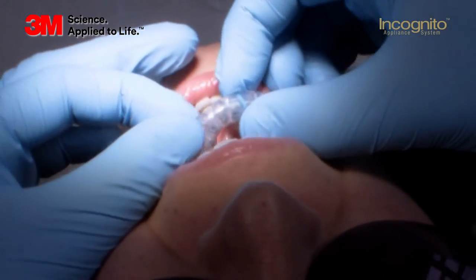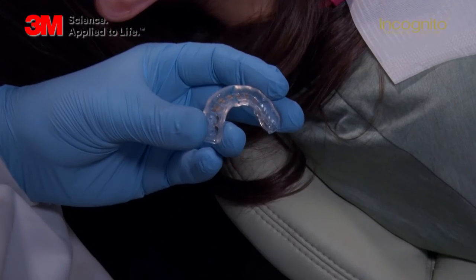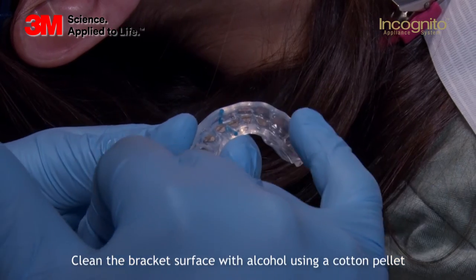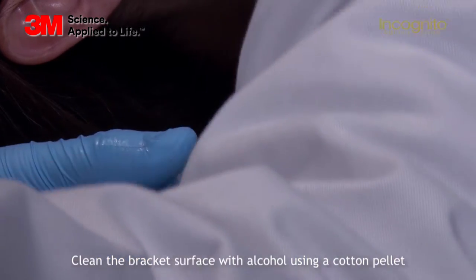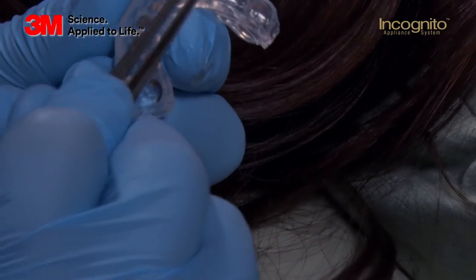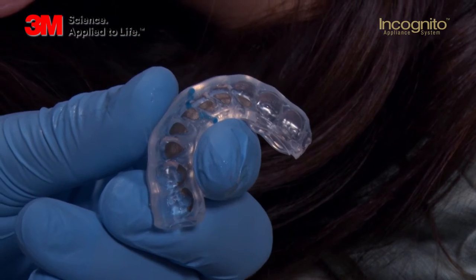After removing the tray, you have to clean the lingual surfaces. Would you pass me a cotton pellet and some acetone please? For cleaning the lingual surfaces, we use acetone and a cotton pellet. After cleaning the surfaces, we will dry them.